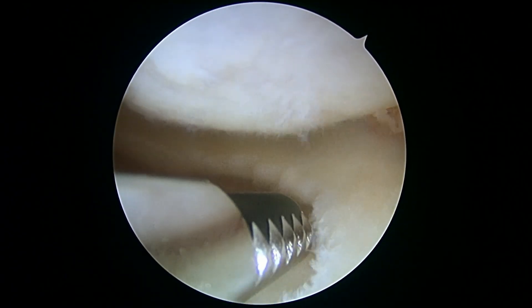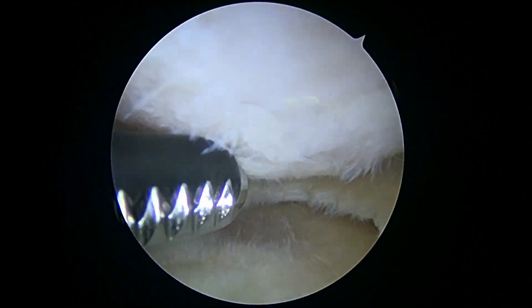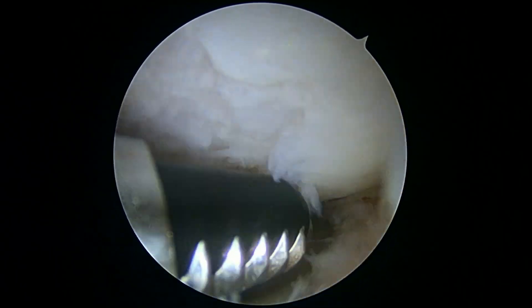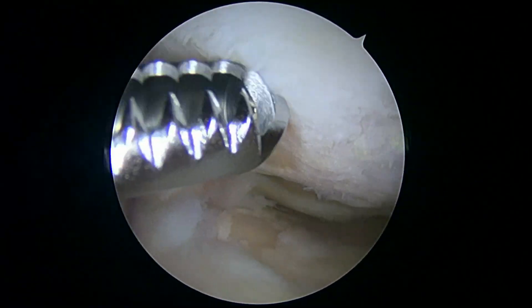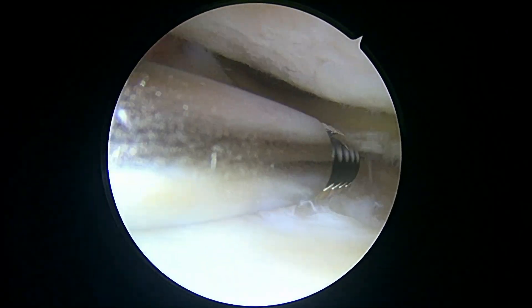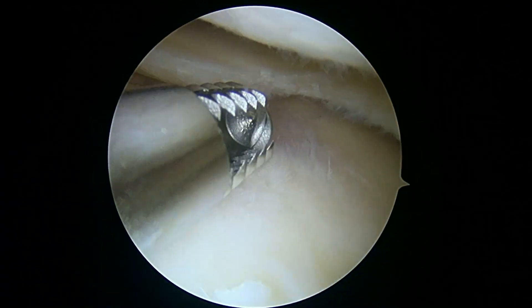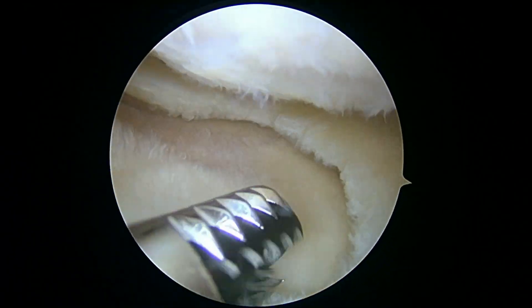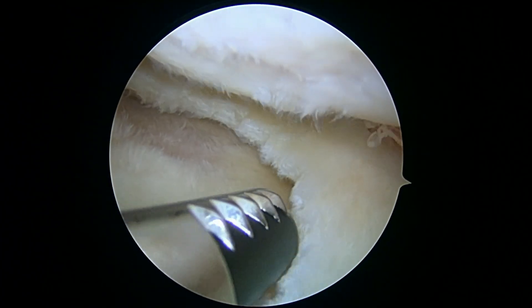That's really all I need to do — we're addressing the pieces of the meniscus that are getting caught in the joint or in this compartment. As you look up at the femoral condyle, you can see that this is rough — there are some loose areas that flake off just with touching them. This is an ongoing process, and that's why the knee was so swollen when we first got started — you had a lot of fluid in the knee. Here's another area where you've lost a lot of cartilage on the lateral femoral condyle. And as we look down at the tibial plateau, this is getting pretty thin also. But at least that's a better appearance than where we started in terms of the potential to cause symptoms.